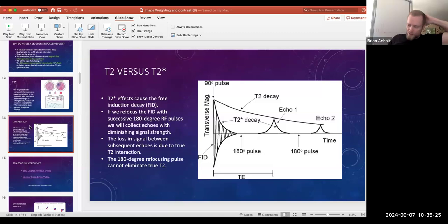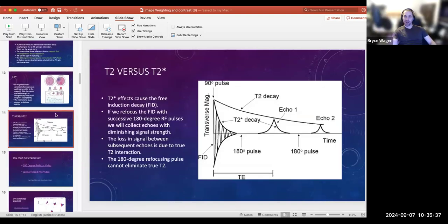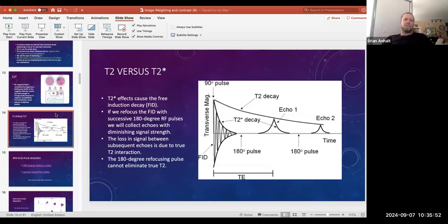I like the question. It's the same questions I asked when I started seeing the breakdowns of all the models, but it's hard to really understand it that way when you start asking those questions that deep. The only reason I asked was because we were talking about the idea that the T2 decay is non-recoverable, and I was trying to get a deeper understanding of exactly what that meant. But you just mean for this model, T2 is non-recoverable. Yeah, T2, until we completely lose transverse magnetization.